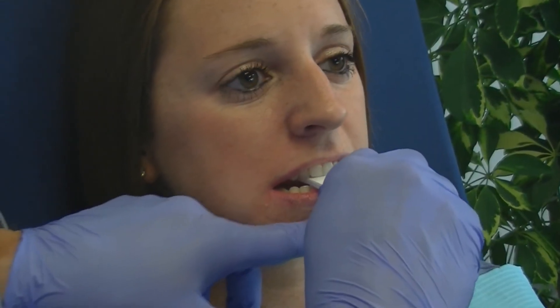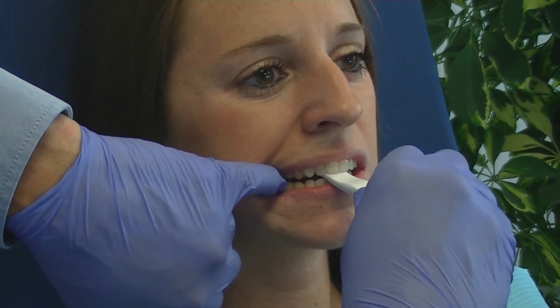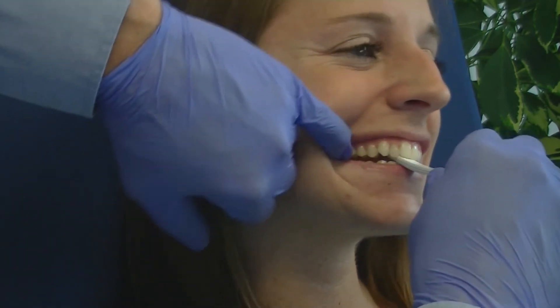Once the required space is confirmed, have the patient slide their lower jaw forward and back a few times, then squeeze. Ask the patient if they feel any tension or tenderness. If mild tension or tenderness is noted, have them repeat the jaw movements and squeeze.